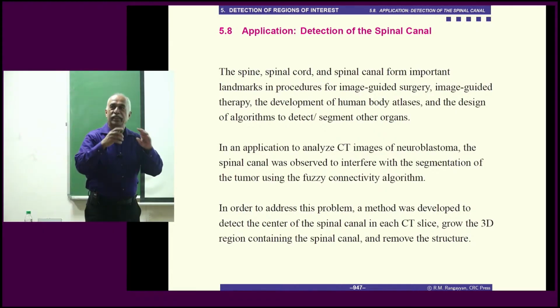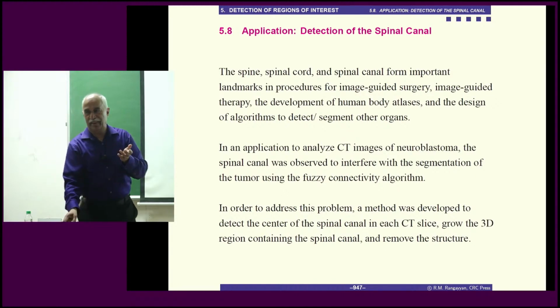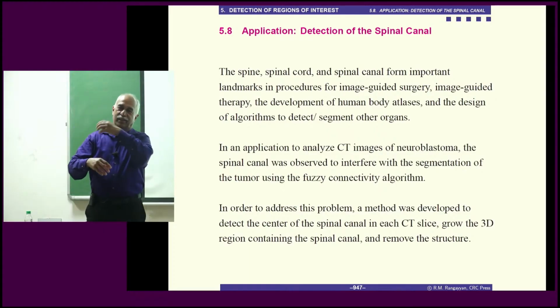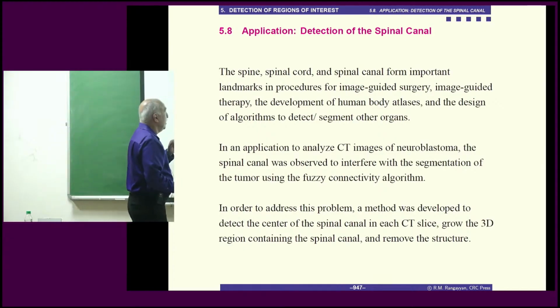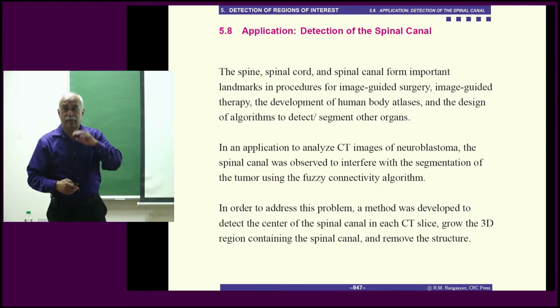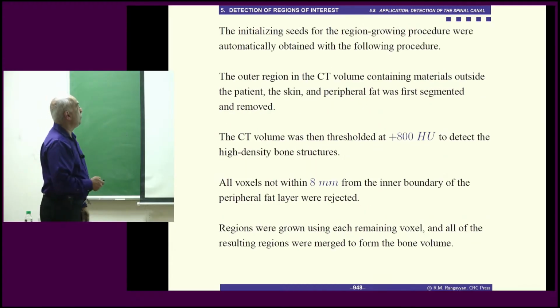So remove everything that is not the tumor. That's what the radiologist also told us. We asked, I can't see the tumor, how do you find it? He said, well, this is the kidney, remove it, this is the liver, and so on. What remains is something suspicious. So there is a process of elimination that could help. So we said, let us detect all these other organs that are causing problems, but they're also important as landmarks. And this will come up later again.